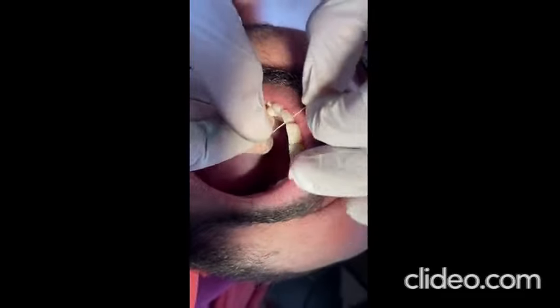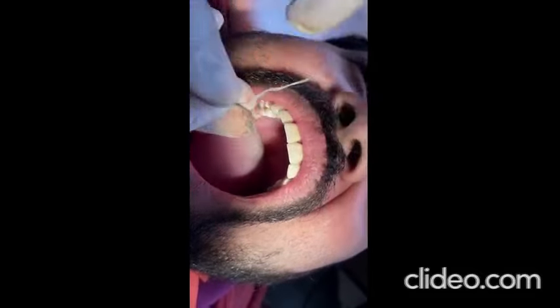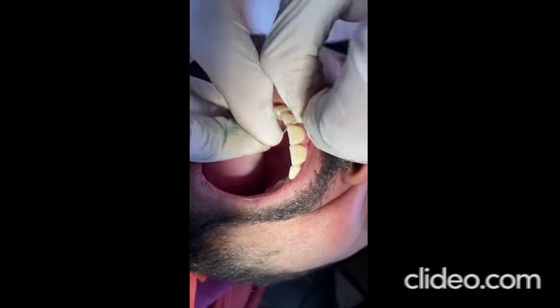Fourth, excellent structural and surface properties due to its high filler content. Fifth, proper excess removal due to its density.